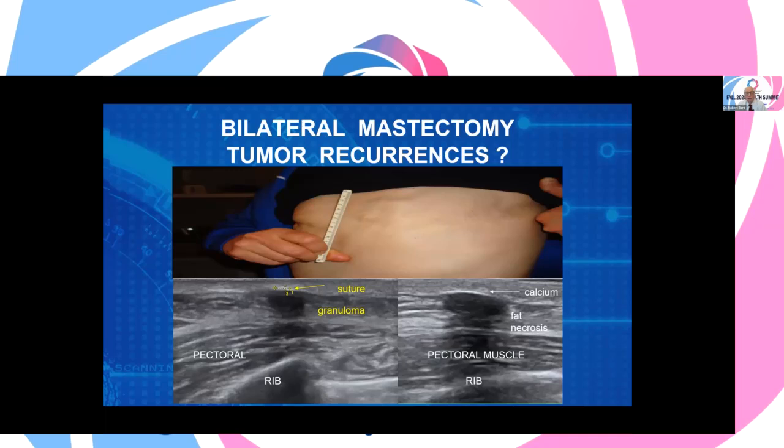Okay, what's going on? Bilateral mastectomies, bilateral lumps. Guess what? Suture granulomas occur. And we're seeing reactions from now metallic clips. They're reacting, the metal is degrading and forming granulomas or even toxic disease in some people now. We've been looking at this. So this is not a recurrence. It's not a lymph node. It's not a metastatic site. It's a benign granuloma in the chest wall.